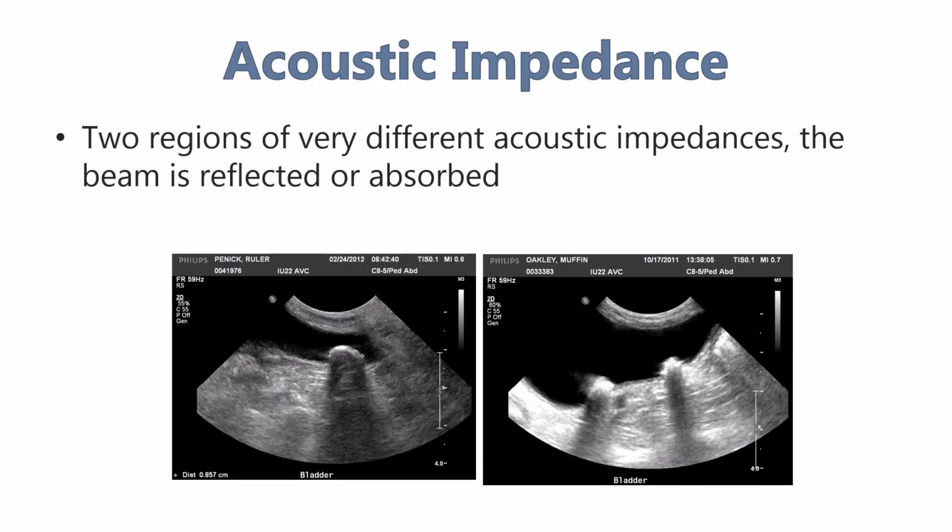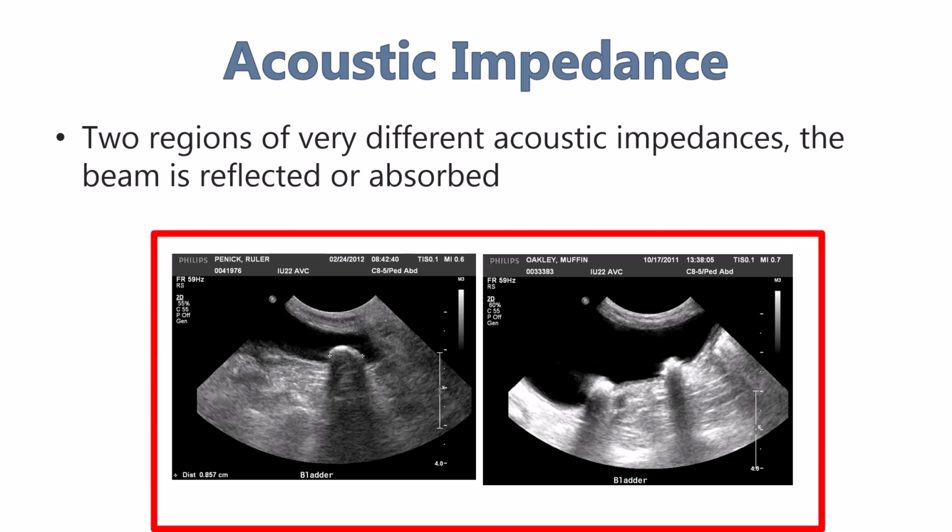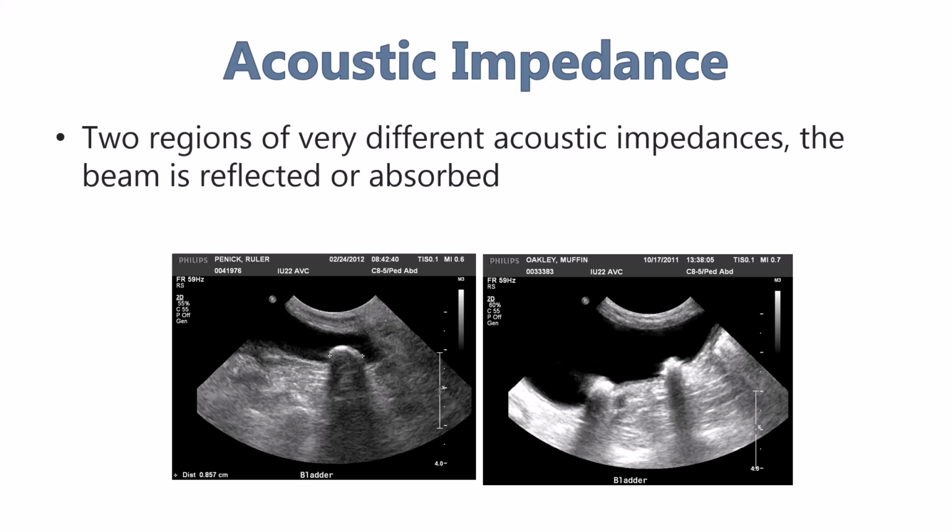How does ultrasound differentiate the different tissues within the body? This is done through acoustic impedance. When interacting with tissue, either the echo will be reflected or absorbed. The amount of difference between the original echo that reached that tissue and the echo after the interaction is the difference in the intensity of the waves or echoes that we're recording to create the images.